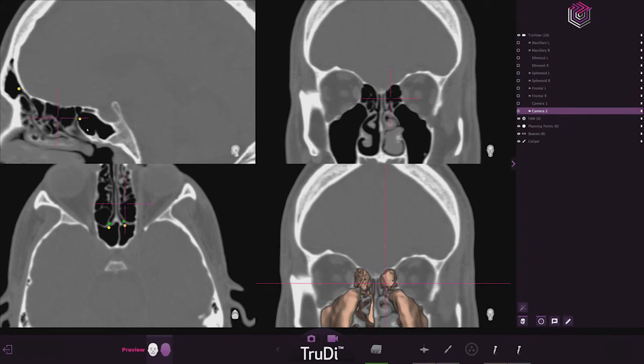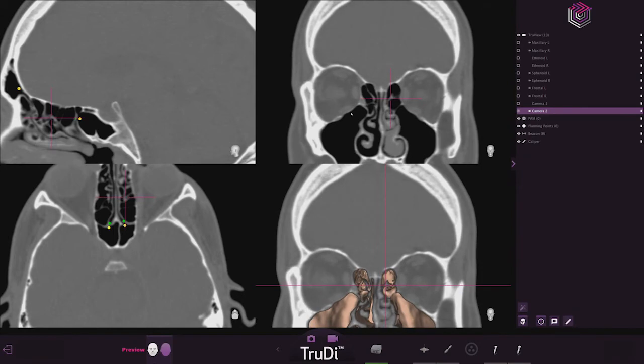And so whenever I plan a case out, I'll typically mark the apertures for all the sinuses because I want to be prepared to do whatever sinus I feel is going to be necessary or achievable at that setting. What I don't want to do, in other words, is wish I'd planned a point out and then have to kind of break out of what I'm doing to try to plan a new point in the middle of the case. So I'll always mark everything out. What we actually wind up doing, maybe we'll get 4, maybe we'll get 2, maybe we'll get 6.